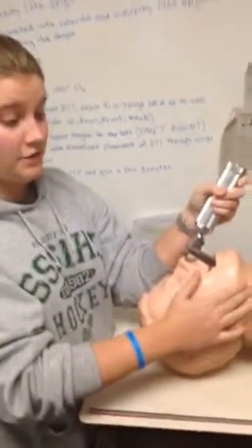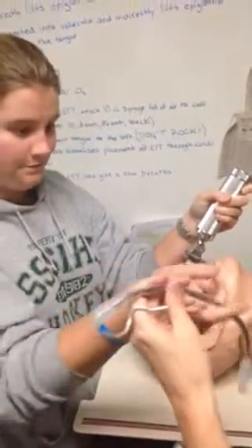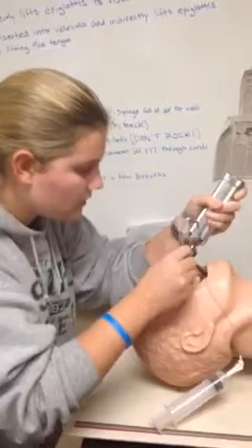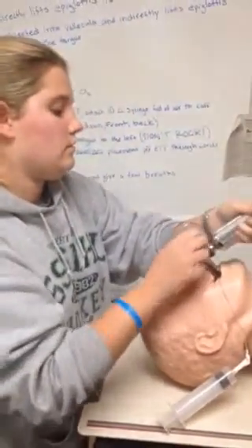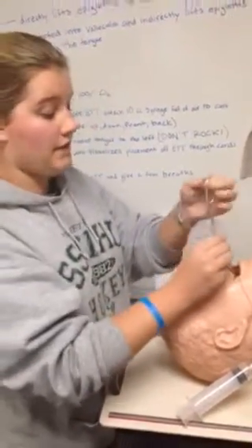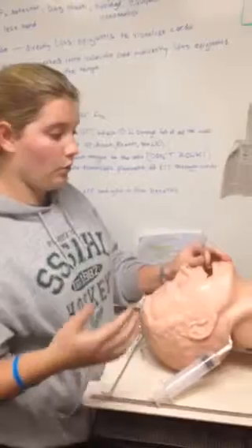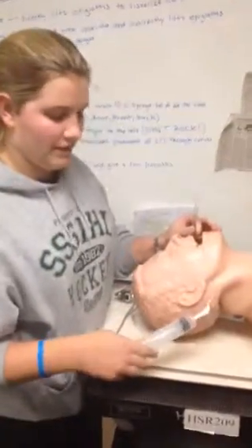I will now ask for the ET tube because I am visualizing the vocal cords. Once the tube is placed, you can pull the stylet out. You never let go of the ET tube because there's always a chance it can move or you can lose it.